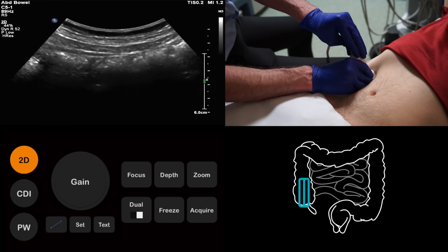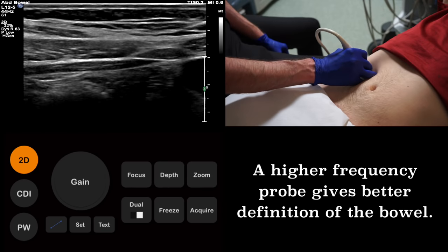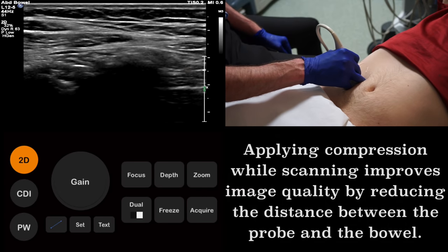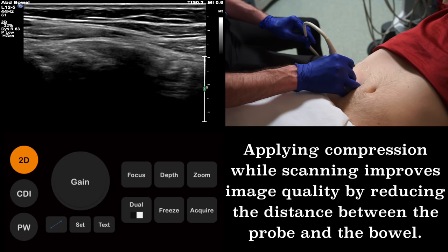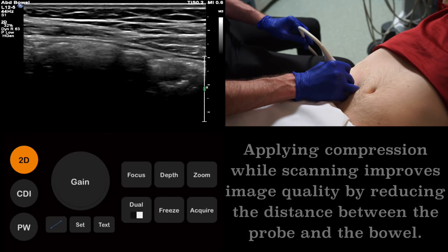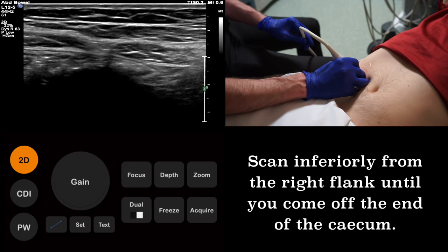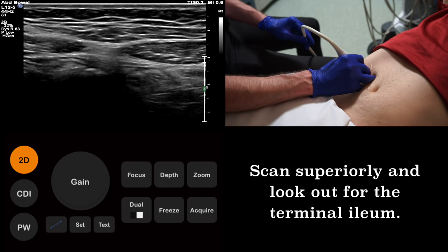We will now change to a higher frequency probe. This will give us better definition of the abdominal structures. You can further optimise your image by applying downward pressure with the probe while scanning. This compresses the intervening soft tissue and improves your image quality. Just as before, we start in the right flank, scanning down onto the cecum, and then back up to identify the terminal ileum.